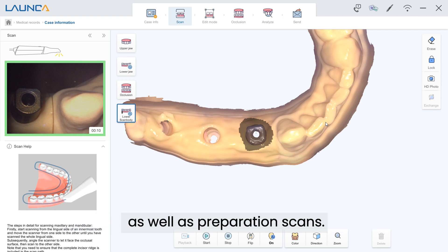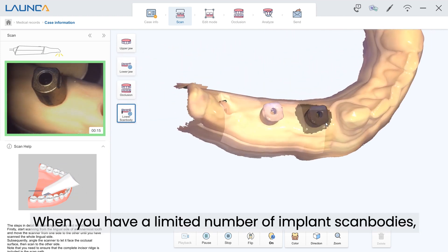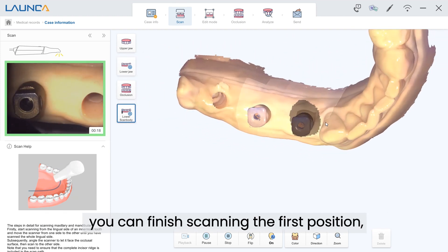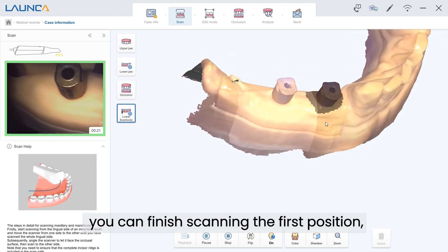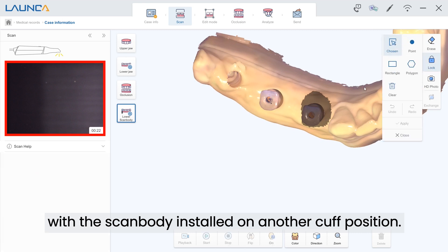When you only have a limited number of implant scan bodies, you can finish scanning the first position, then lock the scanned area, and continue scanning with the scan body installed on another cuff position.